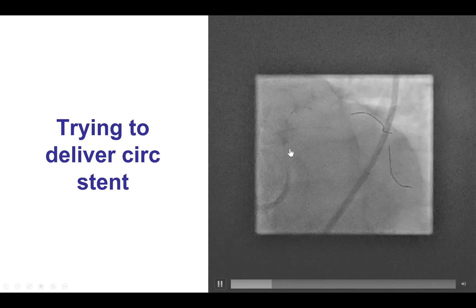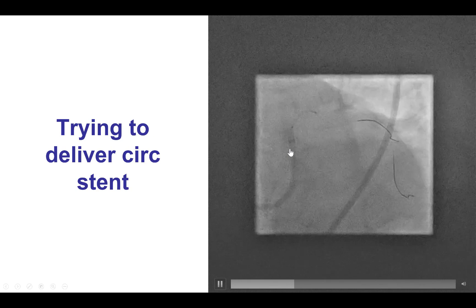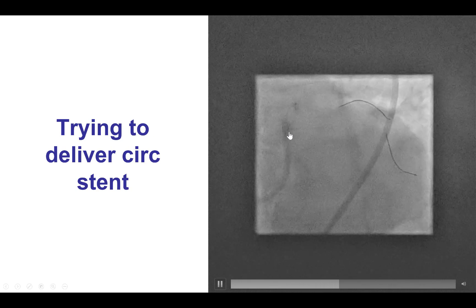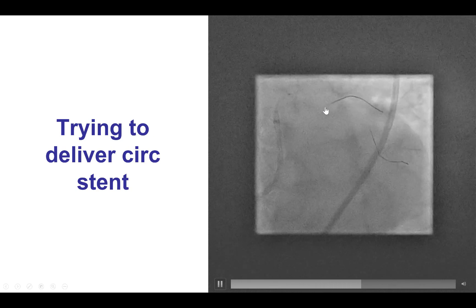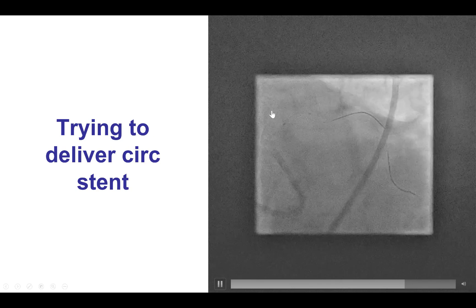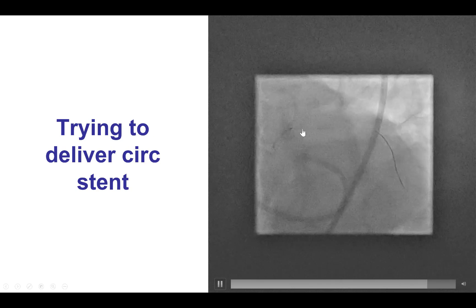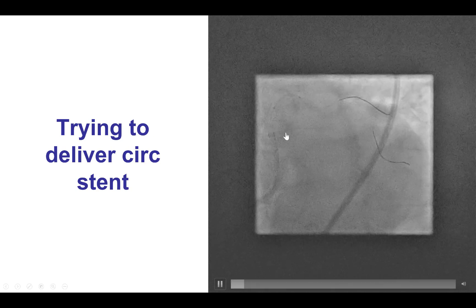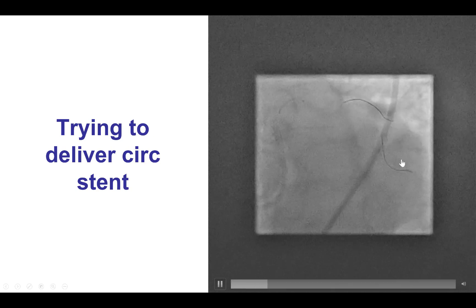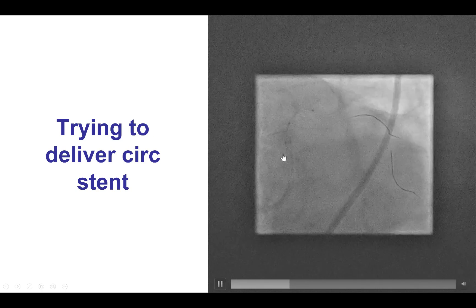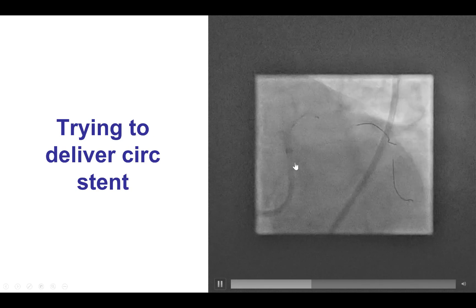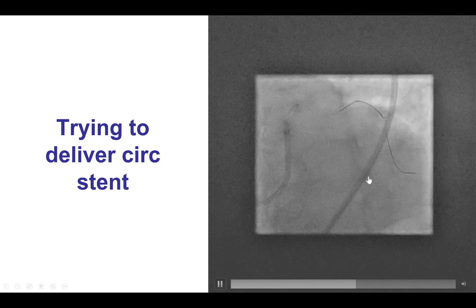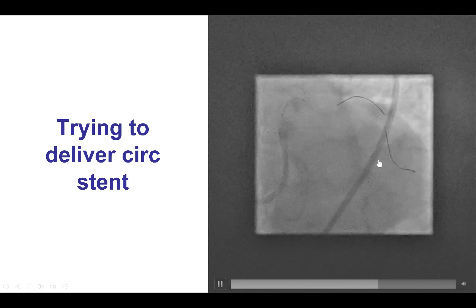Whenever advancing equipment into a vessel, it is critical to pay attention not only at the position of the equipment — whether it's balloon, stent, or microcatheter — but also at the position of the guide wires and the position of the guide, because if this is lost, everything is lost.